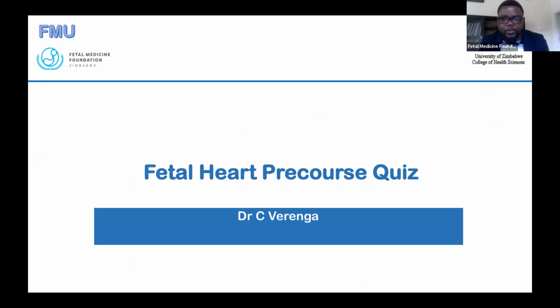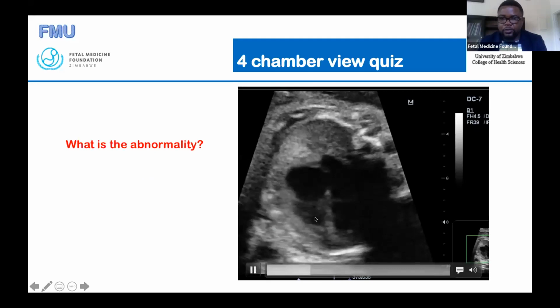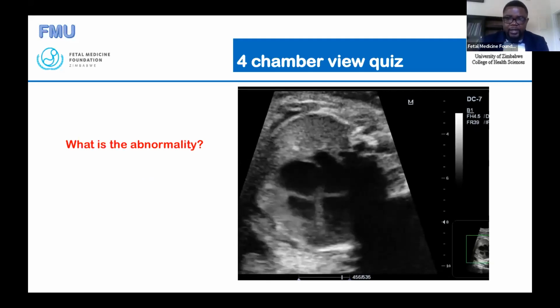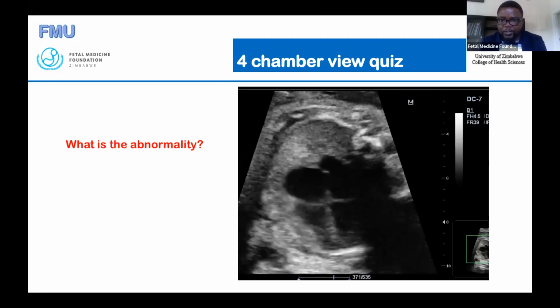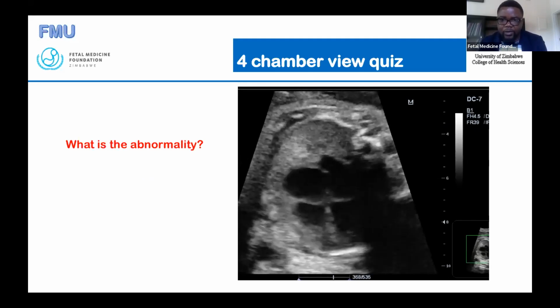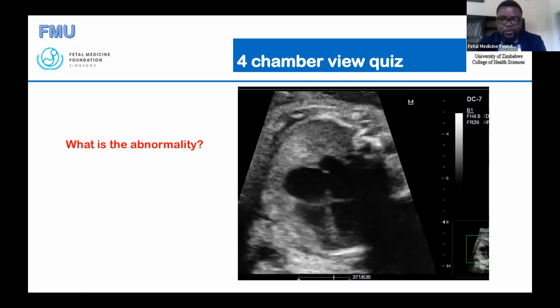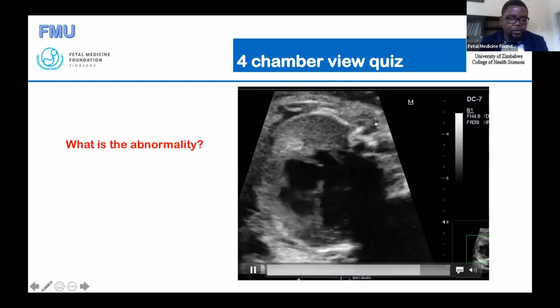But before I do that, I just want to test those who do scans to find out where they are. Again, we're not going to mark you, you mark yourself. I'll play you this short video. In that video, there's nothing there which is frozen, guys. It's a live scanning. What you are seeing is what it is. So don't think there's some slowing of the video. The video is what it is.